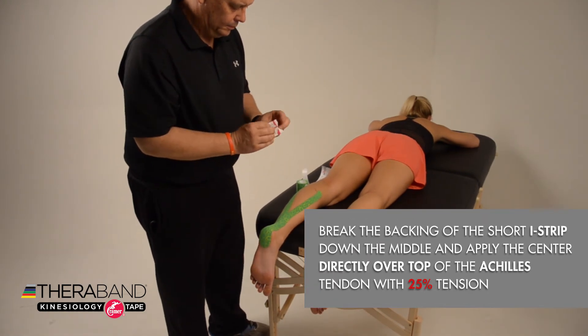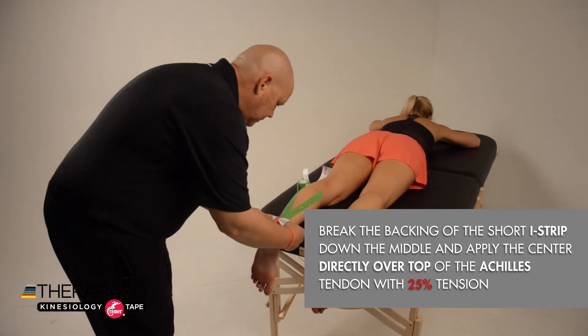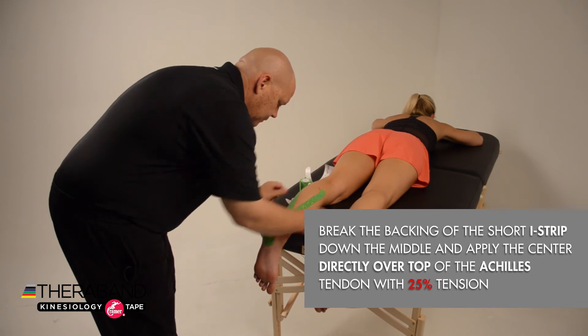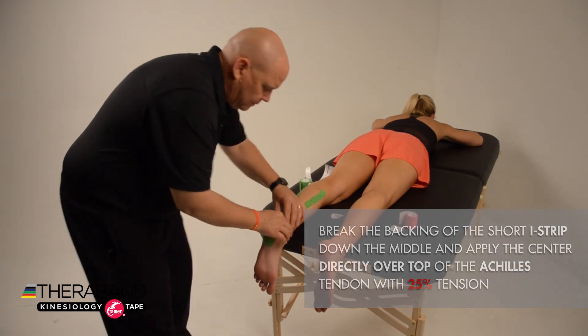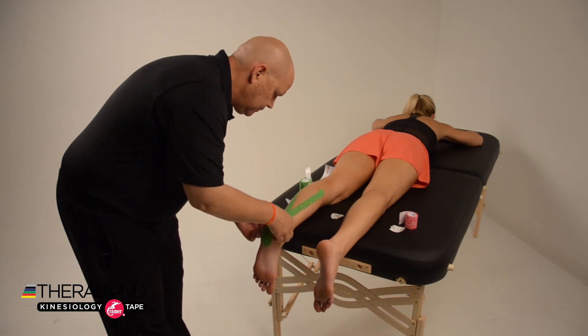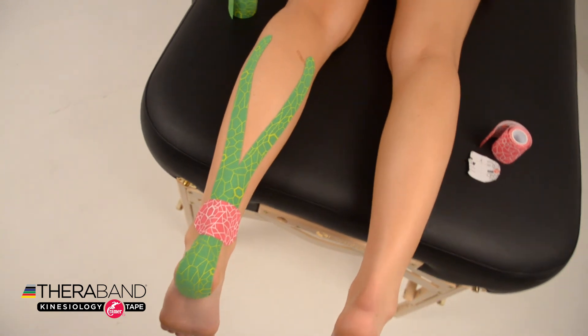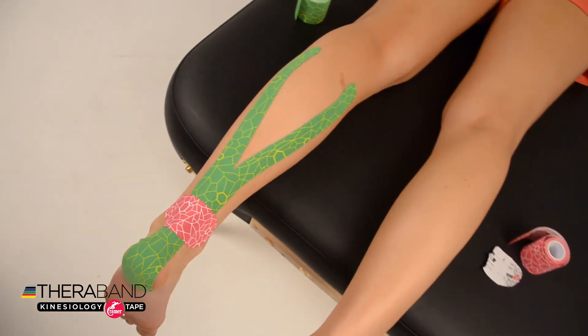Next, apply a short I-strip by breaking the backing right in the middle and placing the center of that I-strip directly on top of the Achilles tendon. Remove the backing and apply about 25 percent tension on the I-strip to hold the rest of the tape job around the Achilles tendon flat. And there we have our Achilles tendon pain kinesiology taping job.